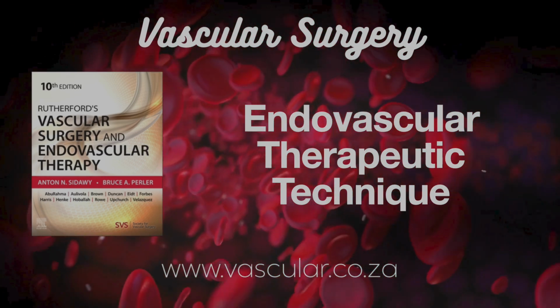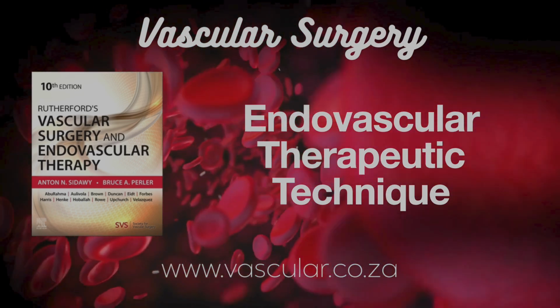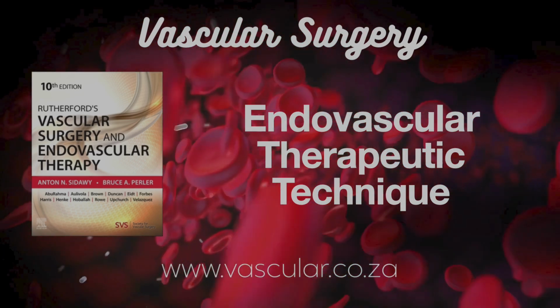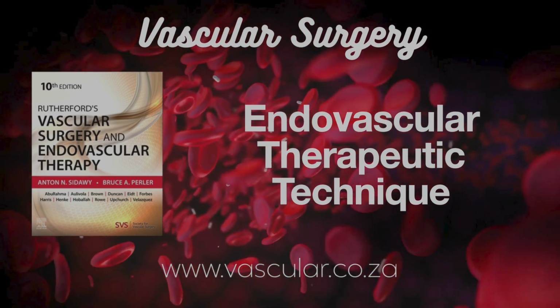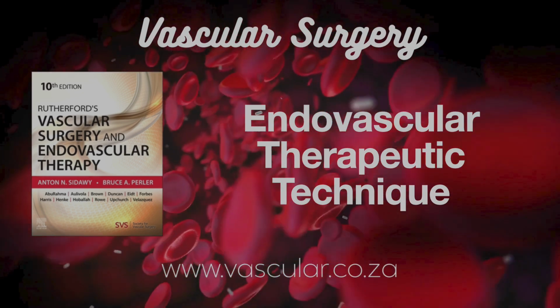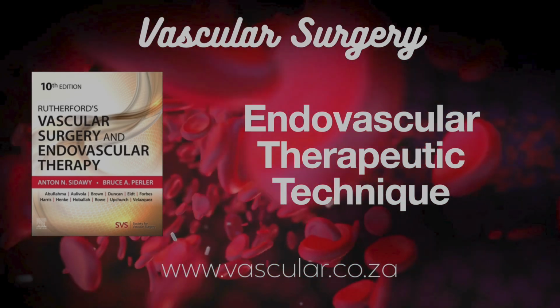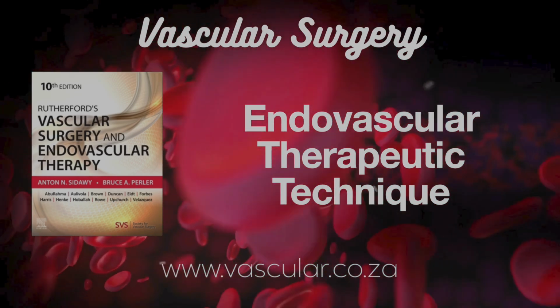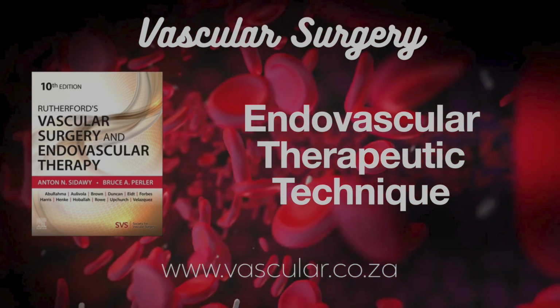One study showed 64% success with aspiration alone in limb ischemia, but 96% when combined with angioplasty and stenting, often used as part of a combined approach. What about rheolytic thrombectomy? Sounds like it uses fluid jets. It does. Rheolytic devices like the AngioJet catheter shoot high-velocity saline jets backward from the tip. This creates a low-pressure zone, the Venturi effect, which helps dissolve and suck the thrombus into the catheter.